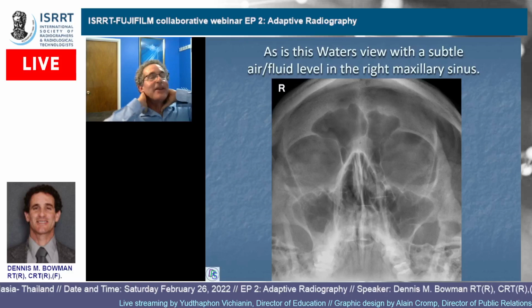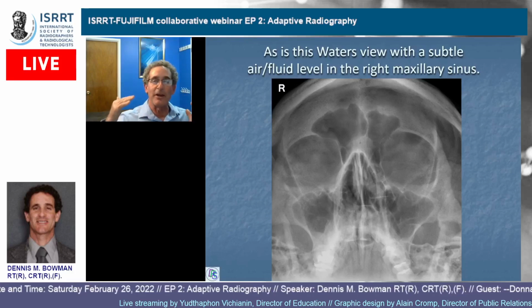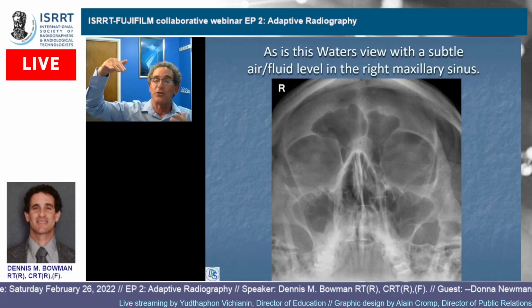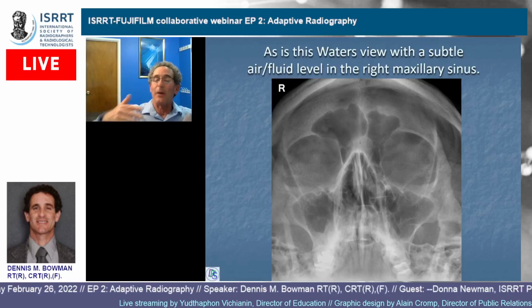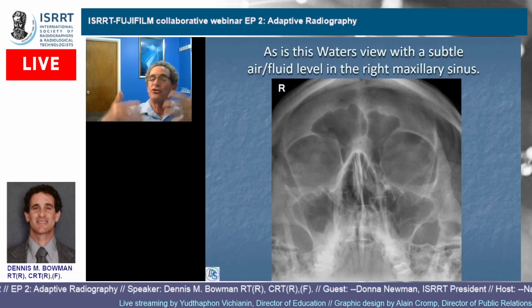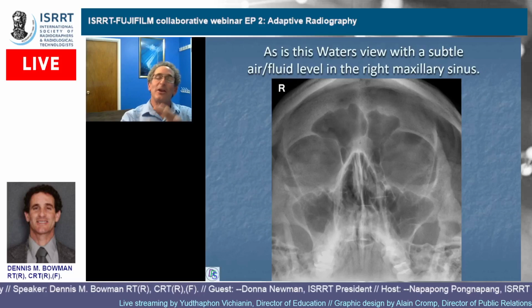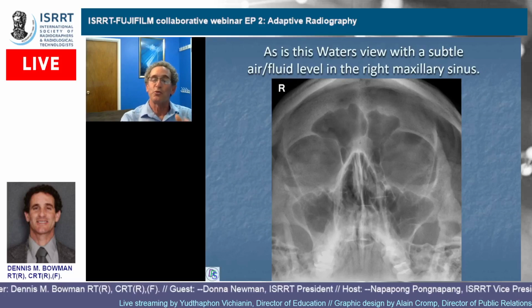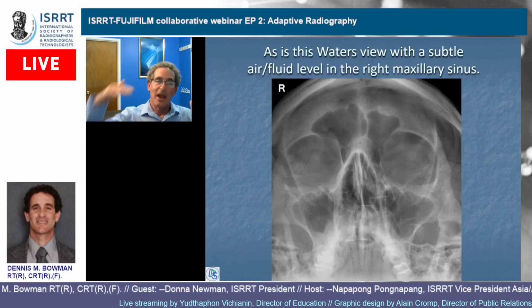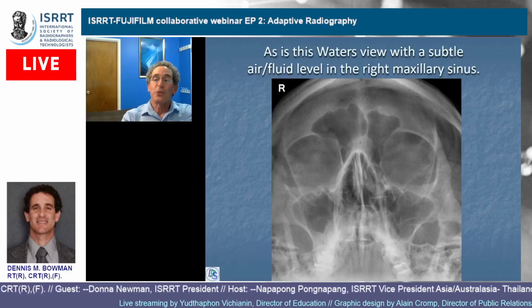And let's say they have a bad neck and they can only get to here. So then you're like, what am I going to do? Well, some radiographers would angle the tube, and then that would still make it be where the Petrus ridges are below. But you have now distorted it, and you might be making an air fluid level disappear. So on anything that you're ever looking for air fluid levels, you really do not want to be angling your tube. Definitely.